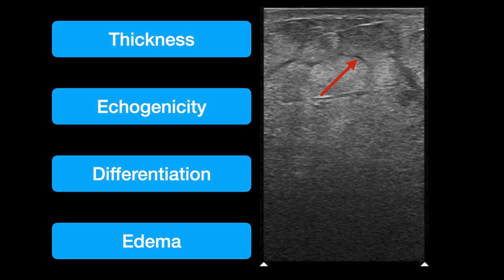So as you have that capillary membrane leakage, as you have that fluid going into the subcutaneous tissues, not all of it's intracellular, some of it's going to be interstitial, and we're going to see those little rivers of fluid throughout that subcutaneous layer.